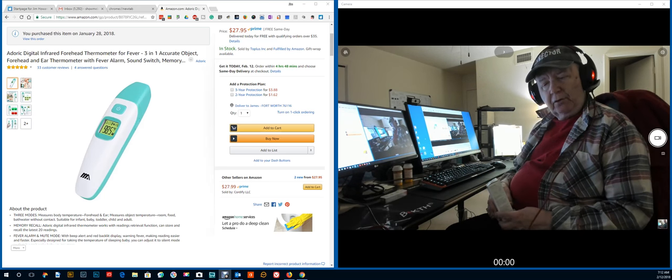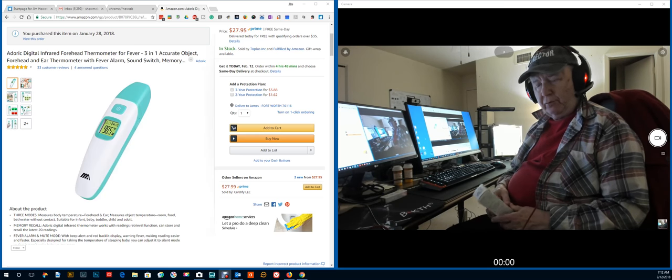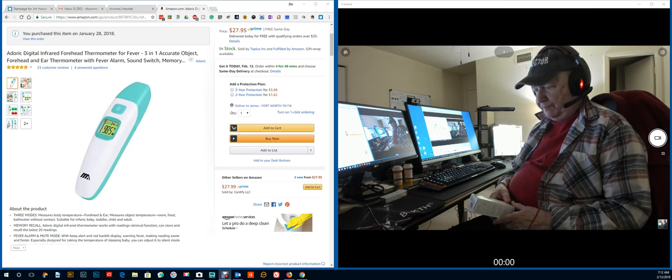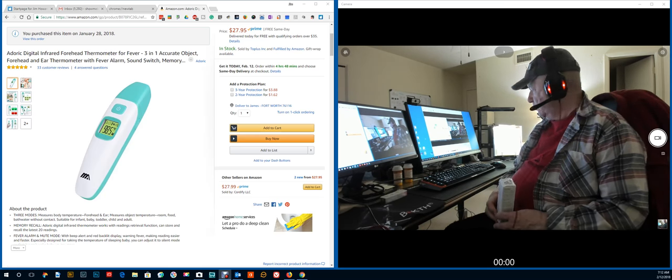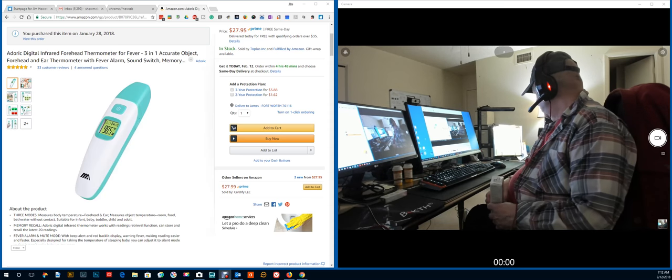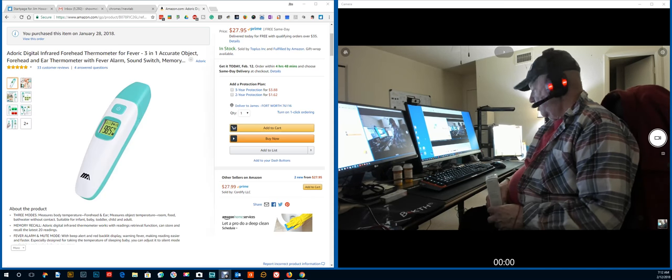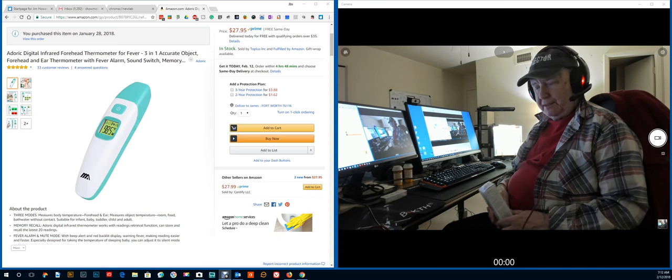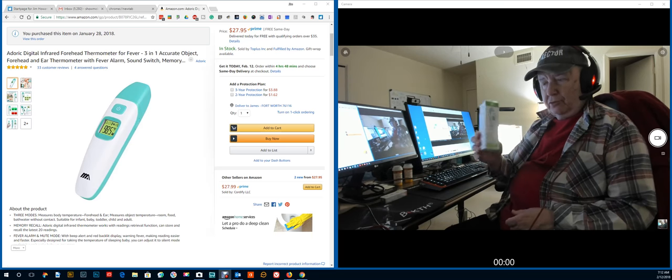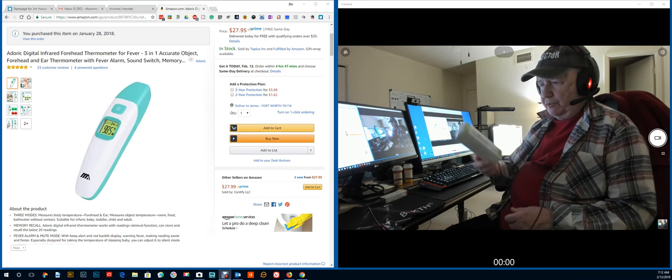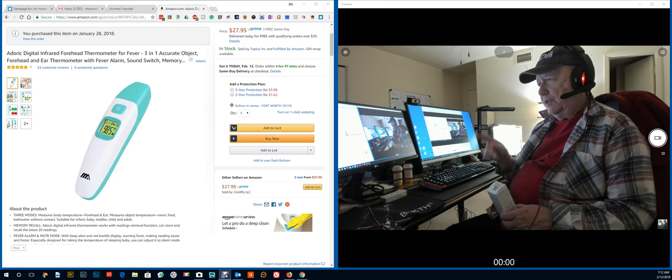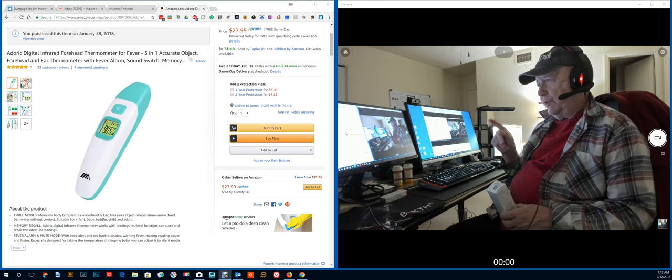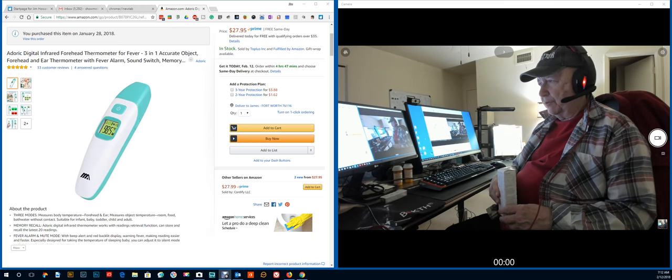Okay, hello there. Jim Howard here in Fort Worth, Texas. Today's date, it is February 12th of 2018. This is a review of this digital infrared thermometer.